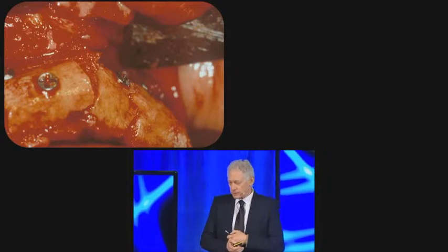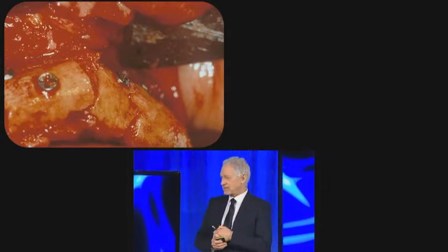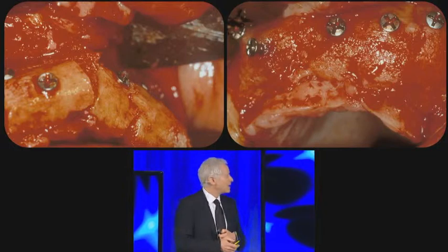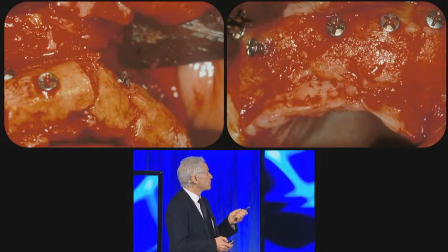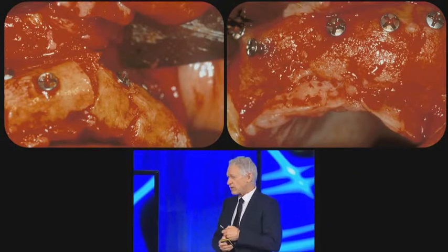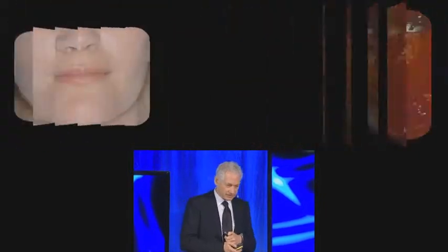Now, when you reconstruct in 3 dimensions, it's very easy to see how successful or how unsuccessful you are, because if you look at it 6 months later, it becomes very clear that I have no resorption on the first 3 screws on the right, but I have about 2 threads showing on the left side. And that's why we always overgraft. To have too much, it's a blessing.